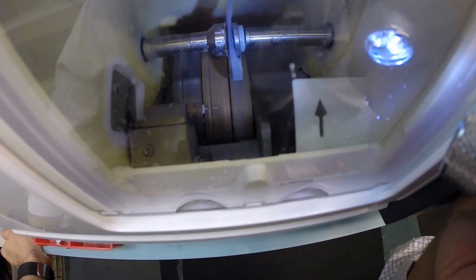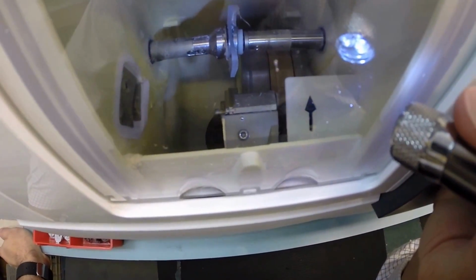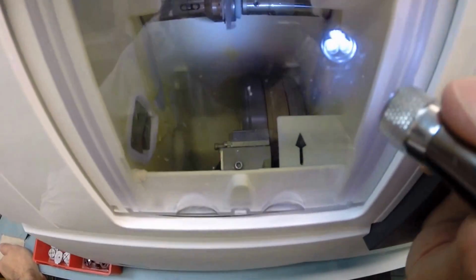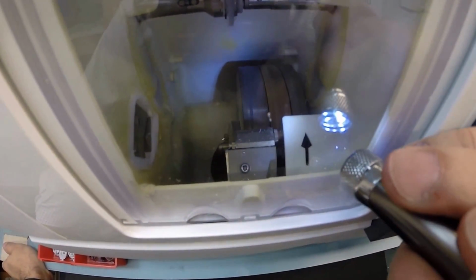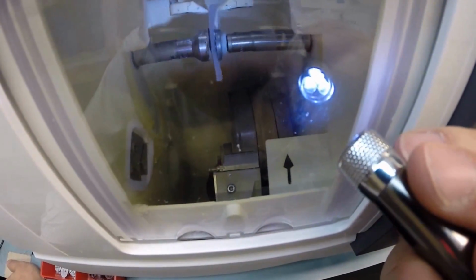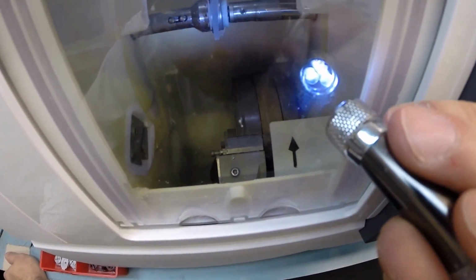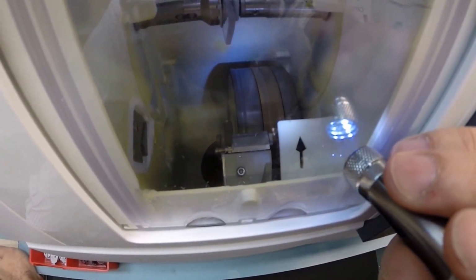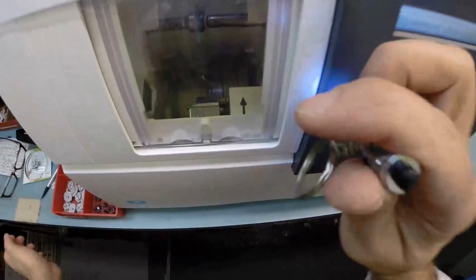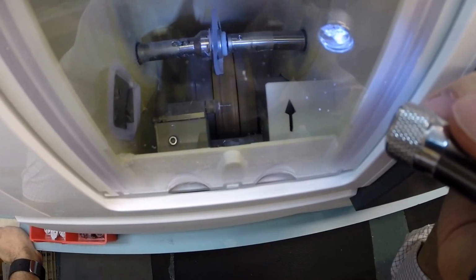If you notice, it's still completely flat all the way around, just like a nickel. If I were to take it out now, I could stand it up on the counter and it would stand up on its own. In just a moment, it's going to move over and then drop down. It's measuring again the thickness at every point a second time to know exactly where to place the bevel. So it's now going to drop down onto the middle wheel, and it's going to get a V-shaped bevel, a knife-like edge. A very dull knife like me, but a knife-like edge nonetheless.